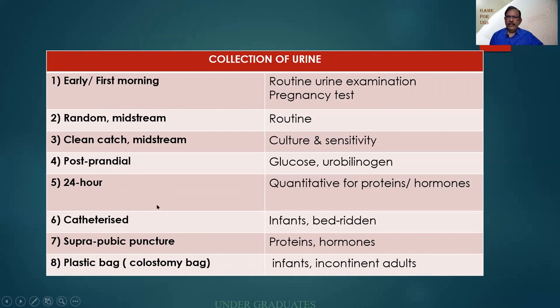24-hour urine for certain tests such as proteins. What is the 24-hour protein? Or for hormone assay. Sometimes I also introduce it for tuberculosis. Catheterized samples for infants and bedridden patients.